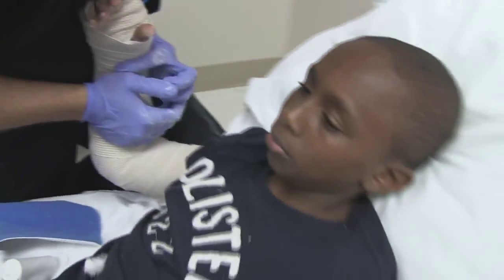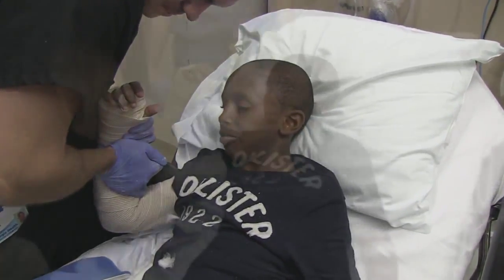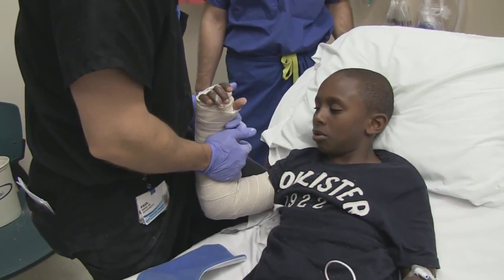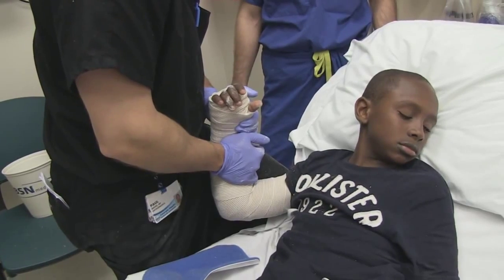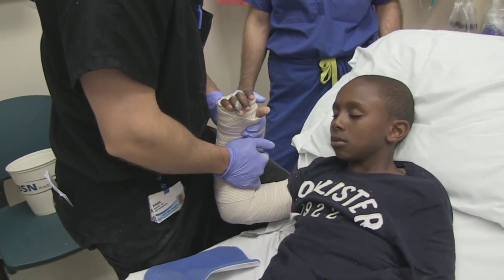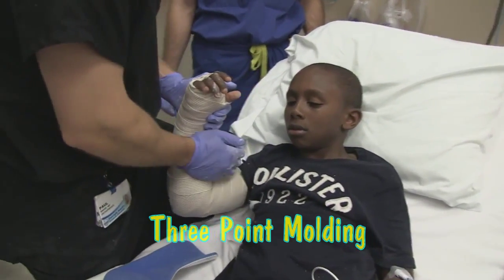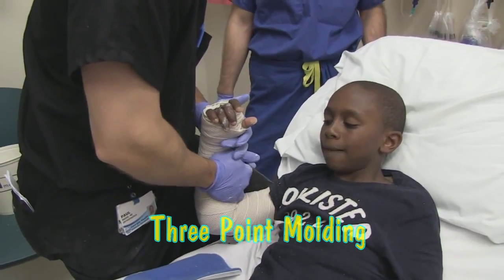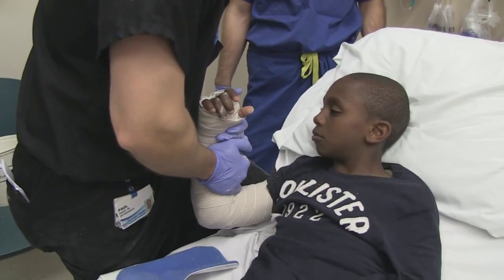So while he's molding that — do you have anything you want to say to your girlfriends? What's your goal on the molding? It's just a three-point mold — standard mold for just the radius fractures. It helps prevent the deformity, and his is off dorsally, so you get a nice curve to the mold. I have my leg as one point, and this is the other one which is proximal to the fracture. The other one is distal to the fracture, and sandwich everything between it using the palms of your hands, not the fingers. Pretty much hold it until it dries.